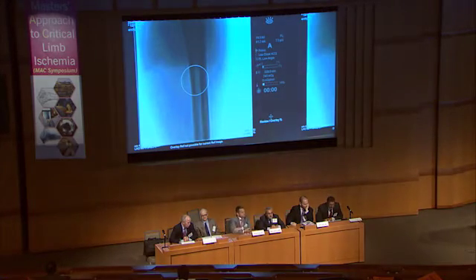So we are in the peroneal. You didn't want to see, which is fine. That's fine. We'll get it. I think in the interest of time, you should just balloon it. You have 20 minutes left, 25 minutes.